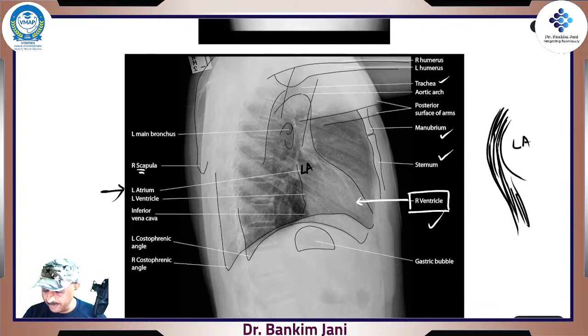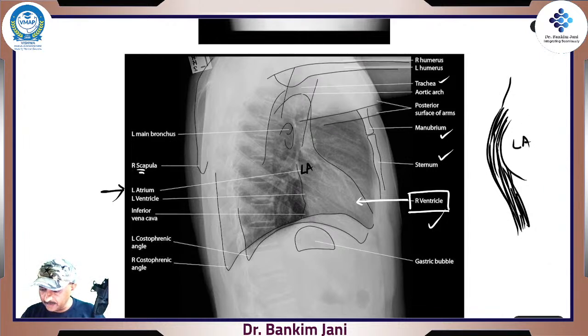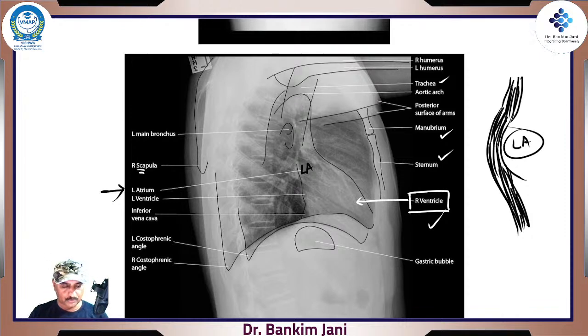You give the barium. Barium means this is like a fluid and it is radio opaque. So you tell the patient, ke chalo mume bhar ke rakho. You take the lateral x-ray, and when you find that esophagus, instead of going like this, right, it is going like this, taking the turn, right? And now you know that on plain x-ray, it is straightening of left heart border, and on the lateral x-ray, on barium or even on normal, you see a graceful curve of esophagus, that means 100% left atrium is enlarged. This is the pressure effect. Right, so that's how you can see.